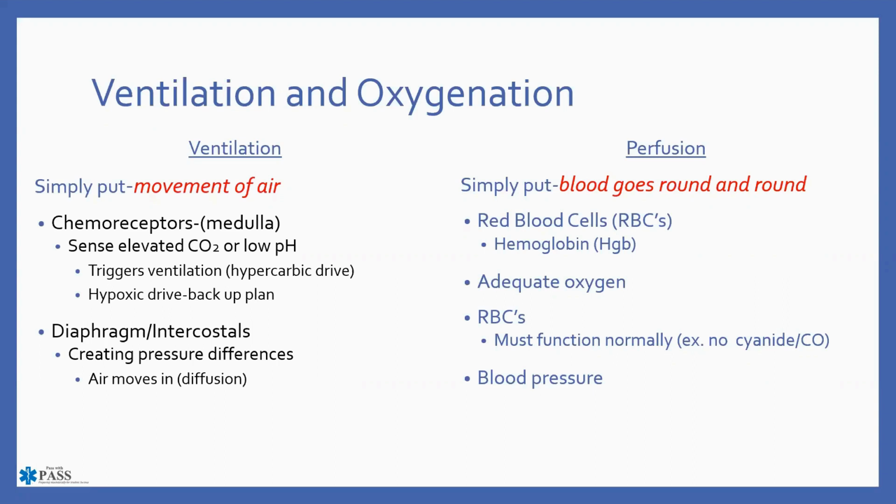And when we get into some of the other ways that we can look at capnography and end-tidal CO2, I'll talk about how we can actually create that for our patients, primarily our pediatric patients, and that would not be a good thing. Hypercarbia can cause a lot of downstream effects that we really don't want. So if we're excessively ventilating the patient, but we're not doing that effectively, we can in fact actually end up causing a little bit of hypercarbia.